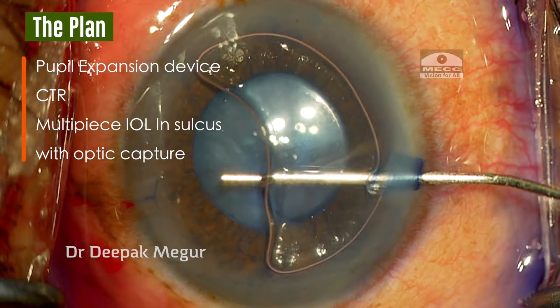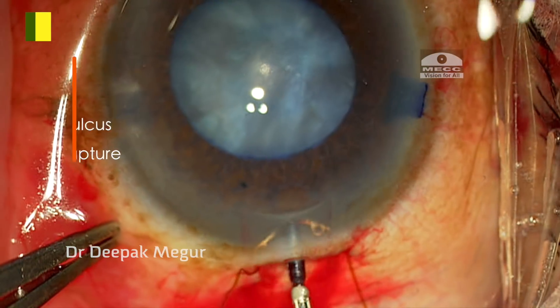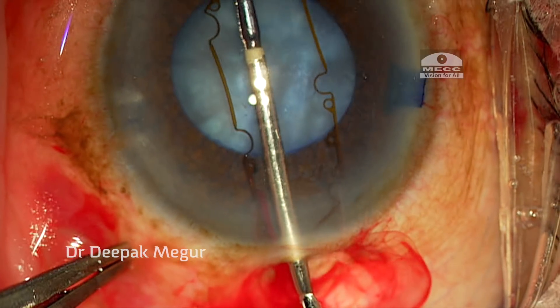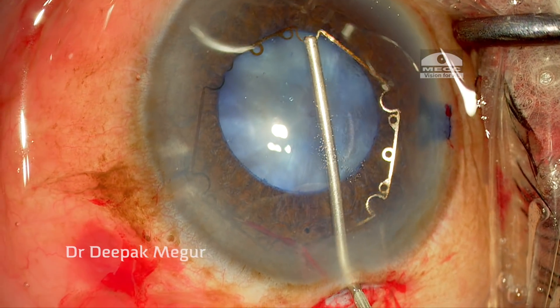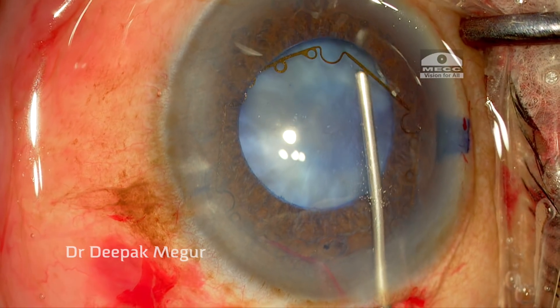This is the B-hex ring innovated by Dr. Suveen Bhattacharji. There is a constant of space here for me to use the rings. I am using OVD just to create some space.